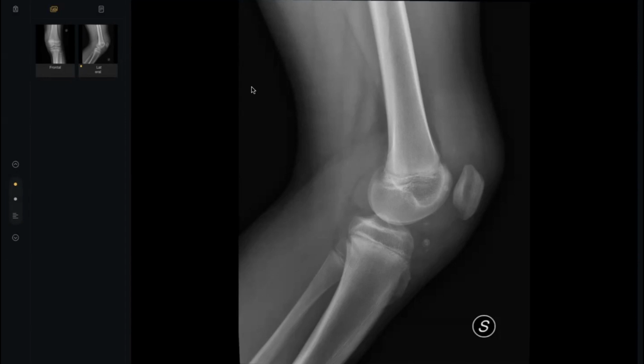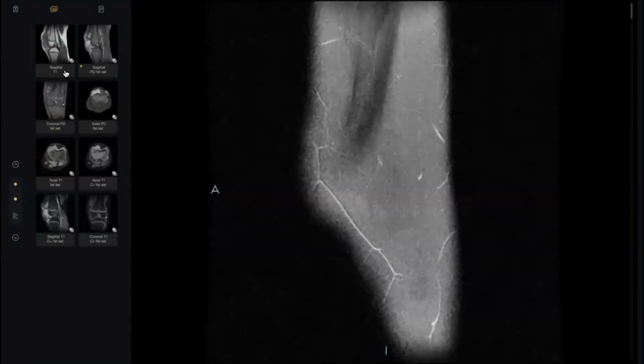I request an MRI to rule out any ligamentous injury, because there was soft tissue edema about the medial aspect. There is no history of trauma, no history of swelling. Okay, go on. Scroll, please.